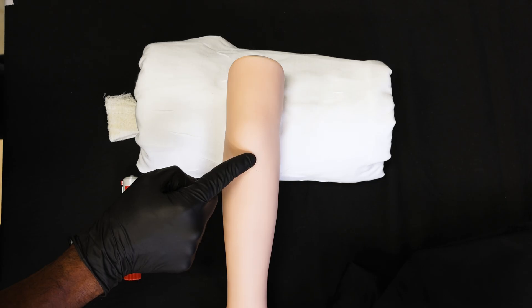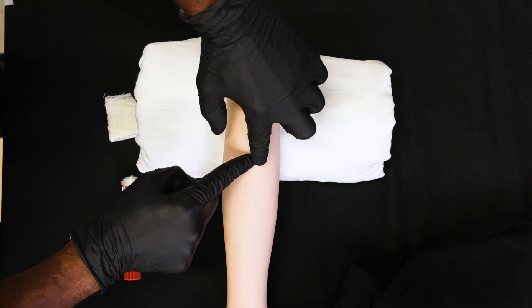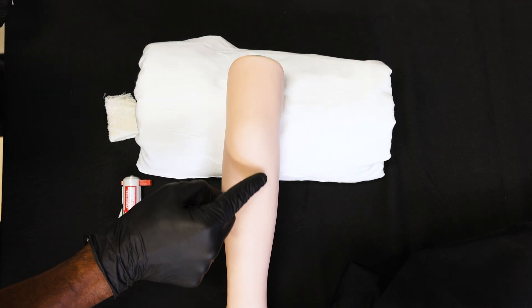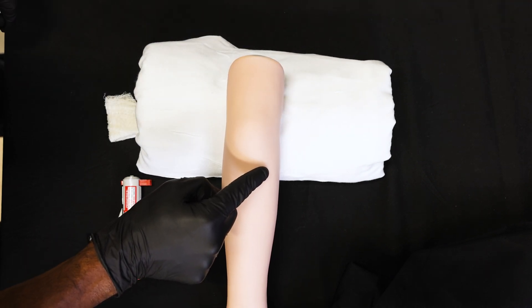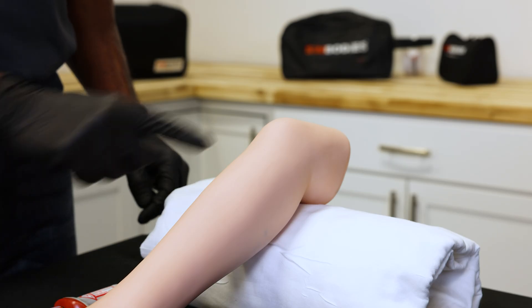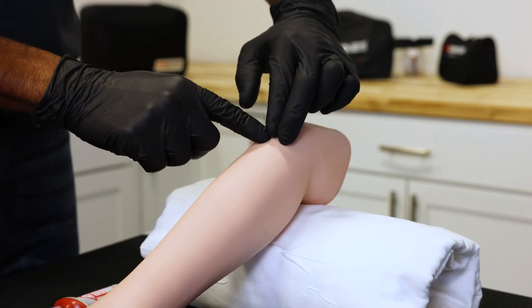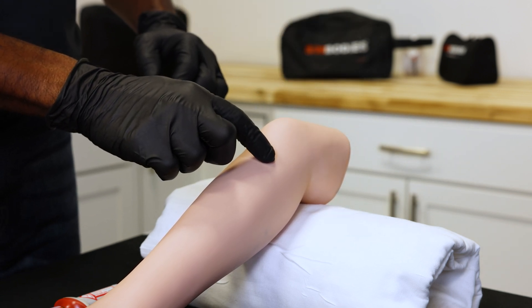First, for ages 0 through 6, from the tibial tuberosity move 1 centimeter medially and 1 centimeter distally to locate the thinnest part of the tibial cortex — this is your IO insertion site. For patients ages 6 through 12, from the tibial tuberosity move 1 to 2 centimeters medially and 1 to 2 centimeters distally to locate the insertion site.